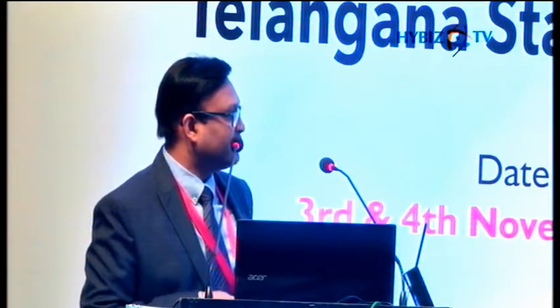They also say that we should optimally do velocity imaging to see low-flow situations, like when we see the IVC, the velocity should come down, and proper gain and proper sector are very important to get good images. Similarly for Doppler, they say these are nothing new to what we have been doing, and there is no addition.